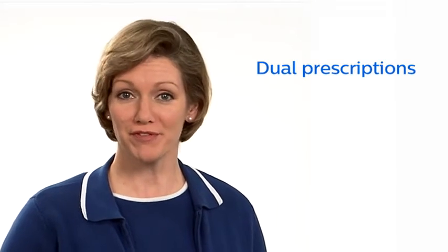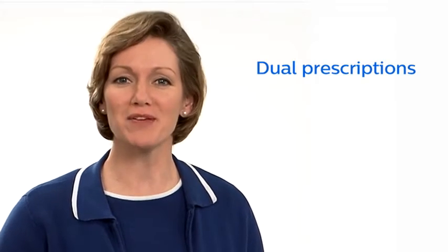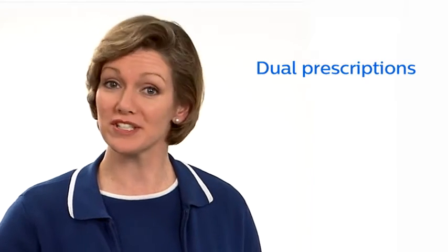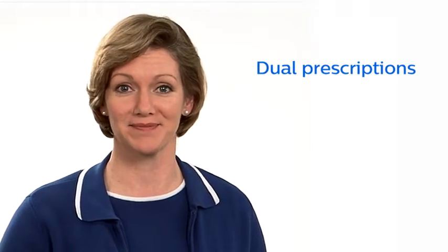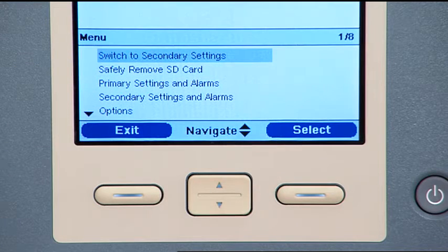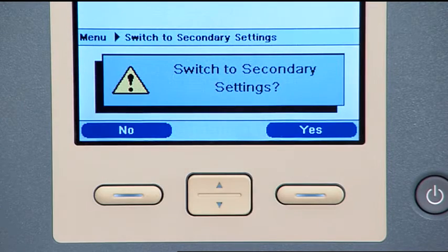If the home care provider has set up a dual prescription, this option will appear on the menu screen. You can change to either your primary or secondary prescription settings. Use the center up-down button to highlight the switch to primary or switch to secondary options. Press the right button to select it.